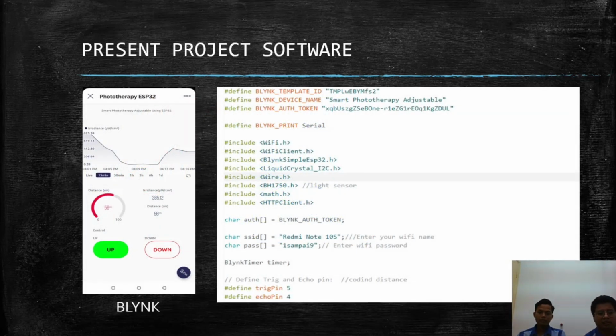This is for the coding software. We use Blynk. This is our interface. The above is the chart, so every time we get the output, we have a gauge and value. For control, we have up and down. When we push up, the distance will go up, and down will go down.